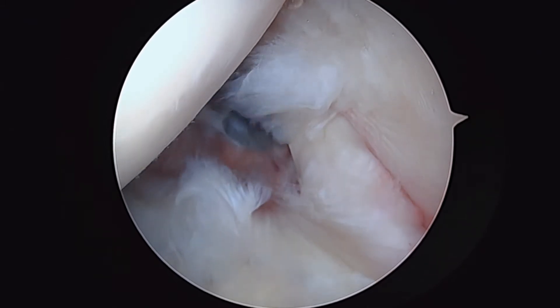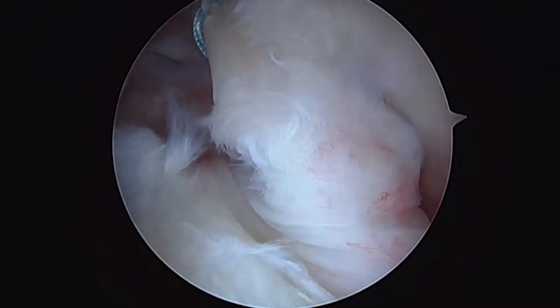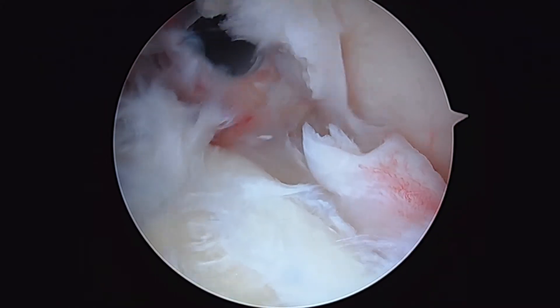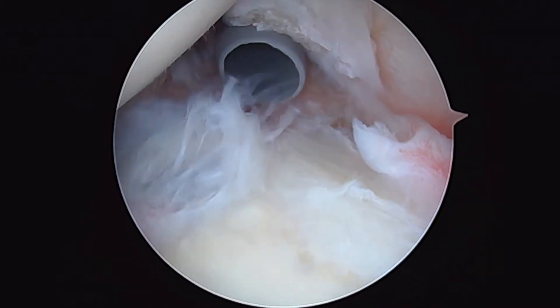So now we've got the biceps secured. We're going to go ahead and take a pair of scissors here and release it. This won't bother the inside of your shoulder anymore because it's going to be detached from this location. Now we'll put in a shaver and clean up the remainder of the labral tissue here.